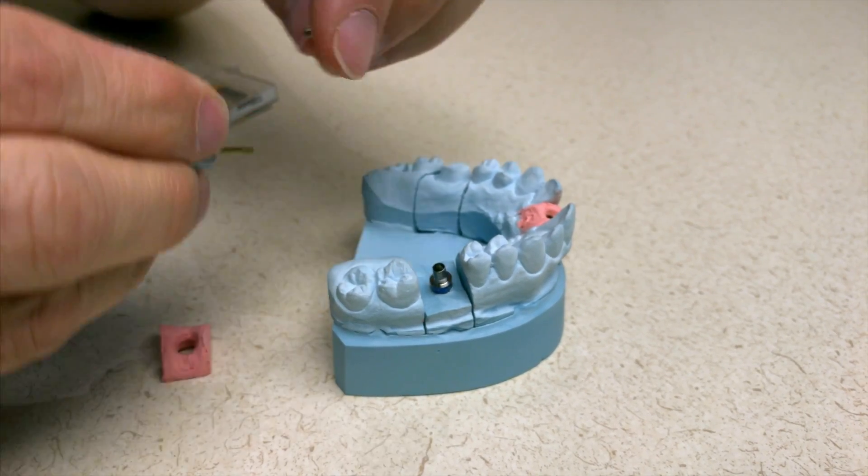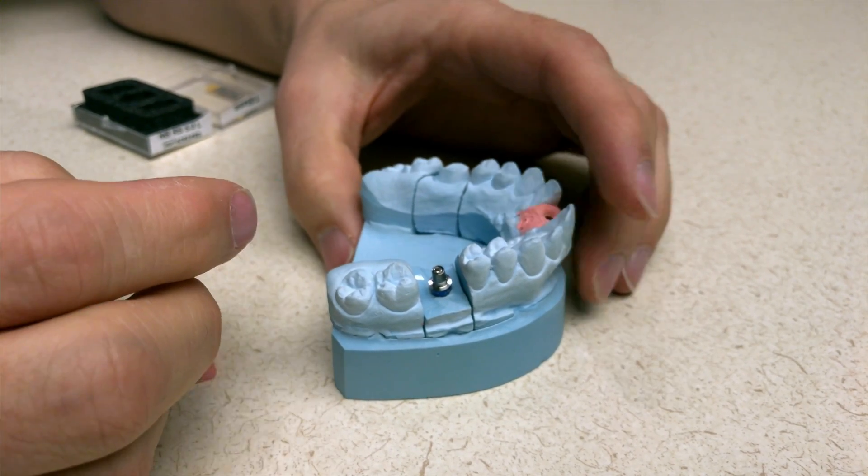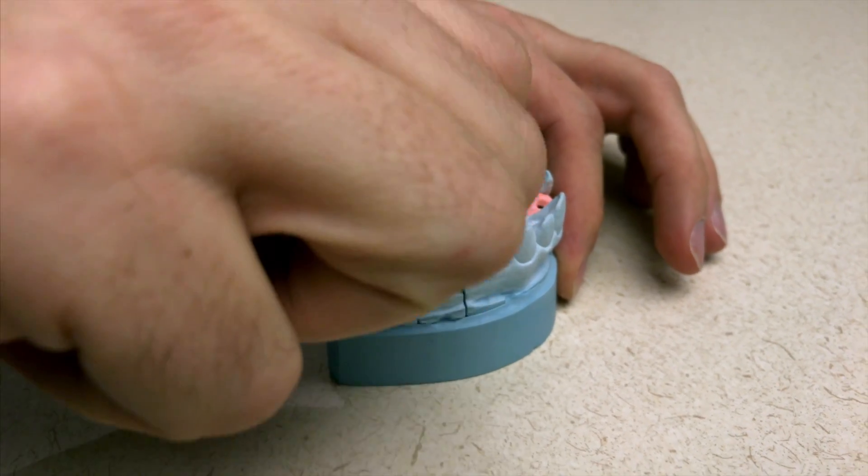You can apply the screw. I recommend a lab screw and not the one that came in the case, because I'm going to use the one in the case as the final set screw. Go ahead and screw it down.